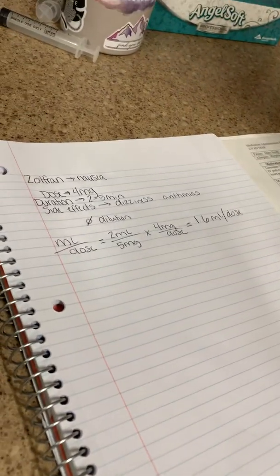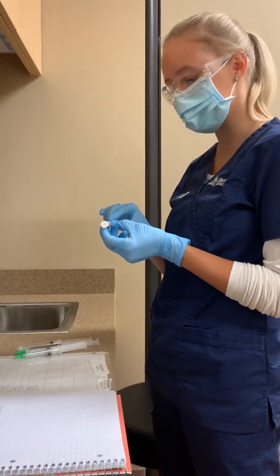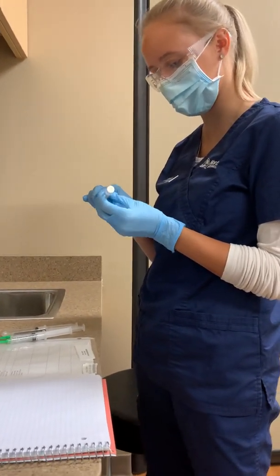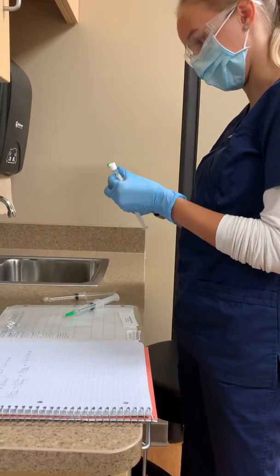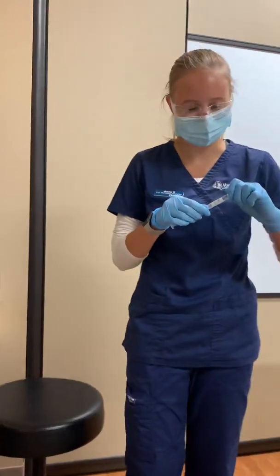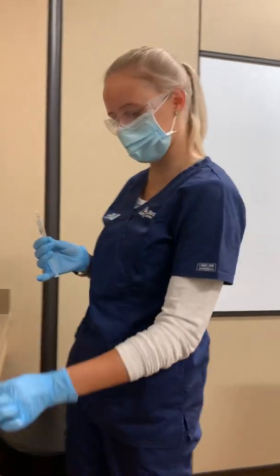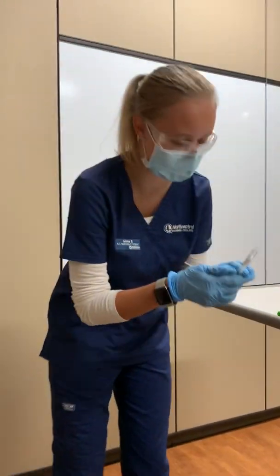So I got all my supplies, my syringes, my medication. The medication is not expired. It's 12 of 2030. And my syringes are all not expired either. So I'm going to get dose accurate so that I can do my 5 checks 3 times.